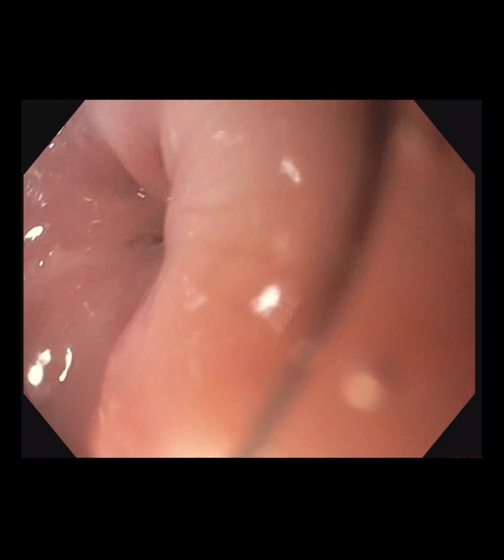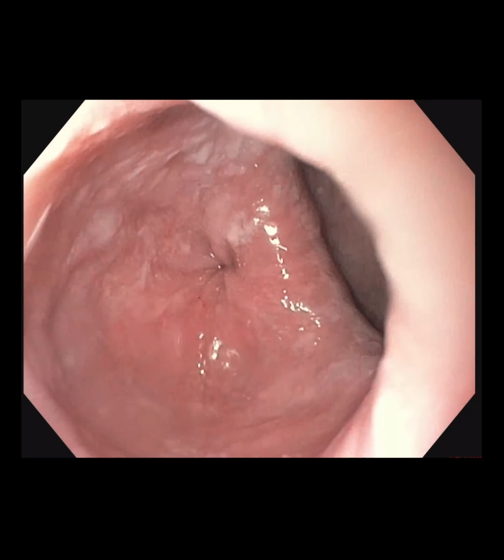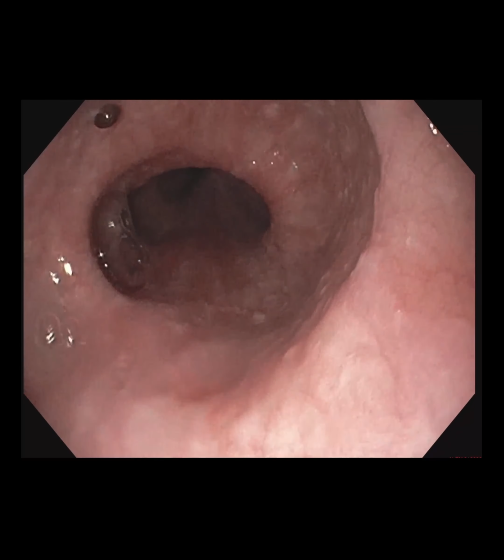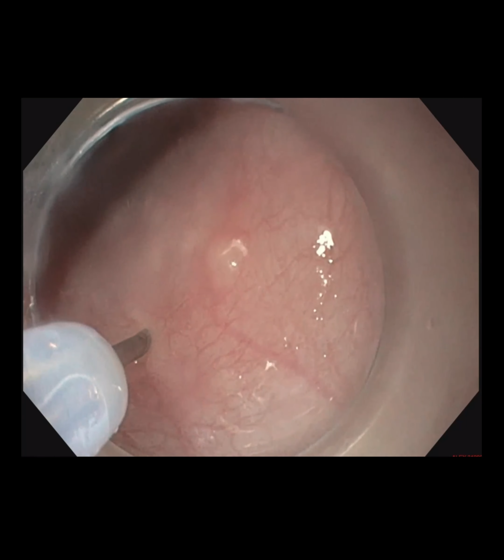On initial endoscopy, there is a large epiphrenic diverticulum measuring around 5 to 6 cm, with the proximal esophagus showing sigmoid type morphology. Following this, the barium shows a significant retention of contrast.